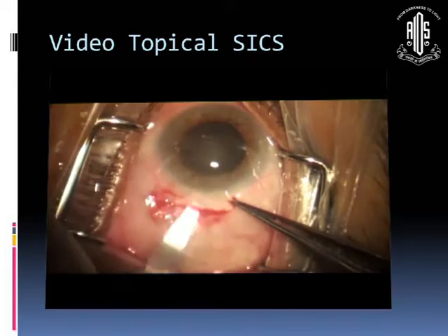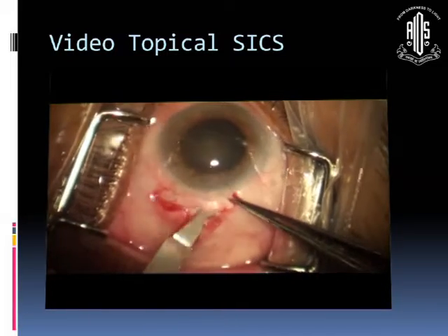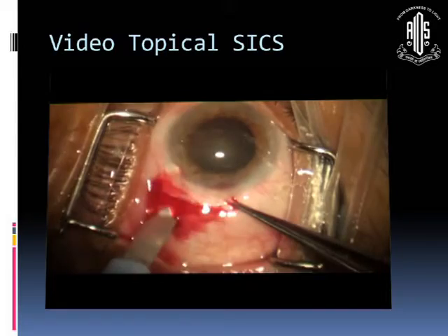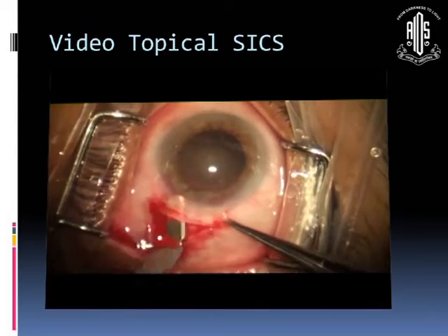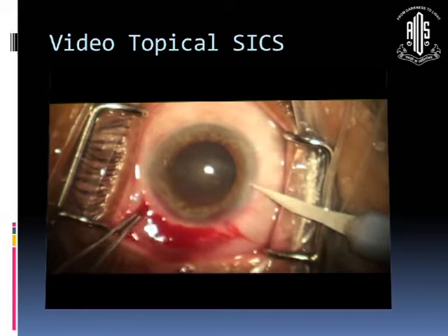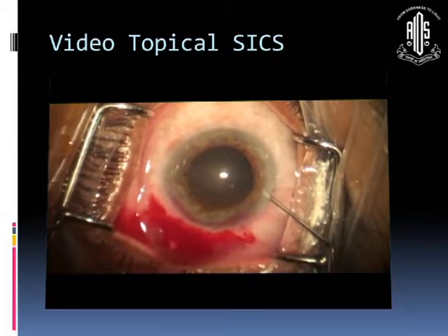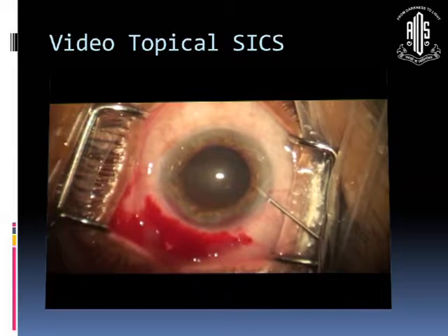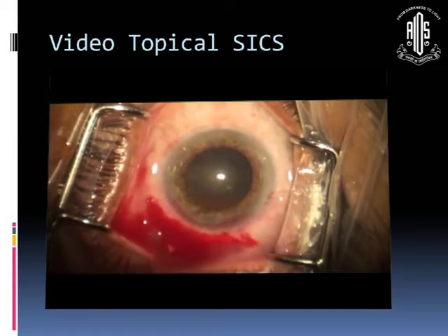While making the tunnel, the hold of the conjunctiva with tenons at its insertion is very important, as there is no rectus suture and the eye will be moving. The iris is anesthetized by lavaging the anterior chamber with 1% preservative-free lignocaine for 20 to 30 seconds.